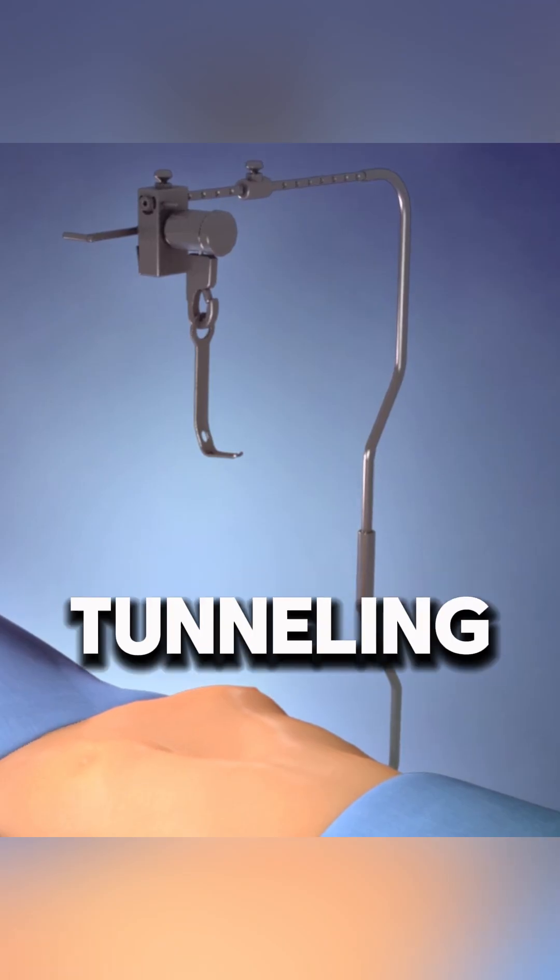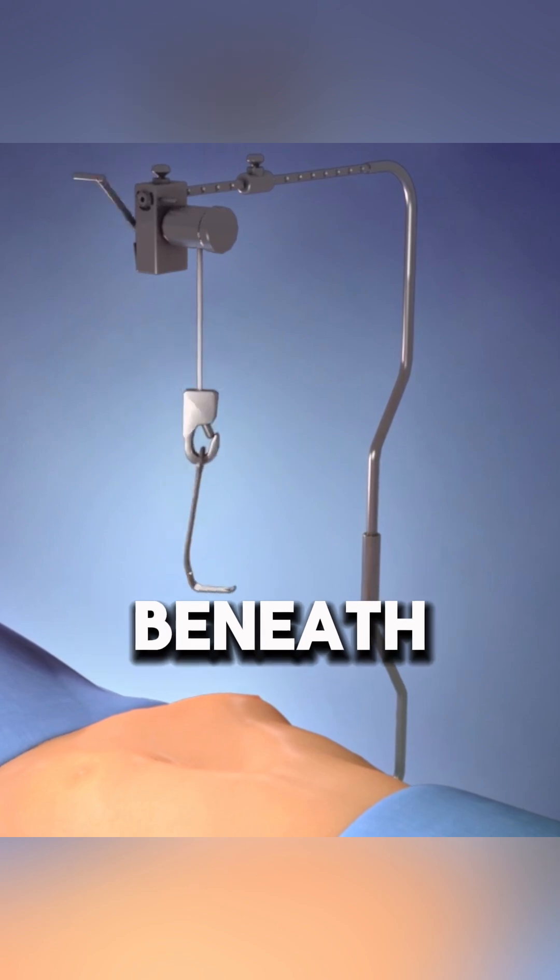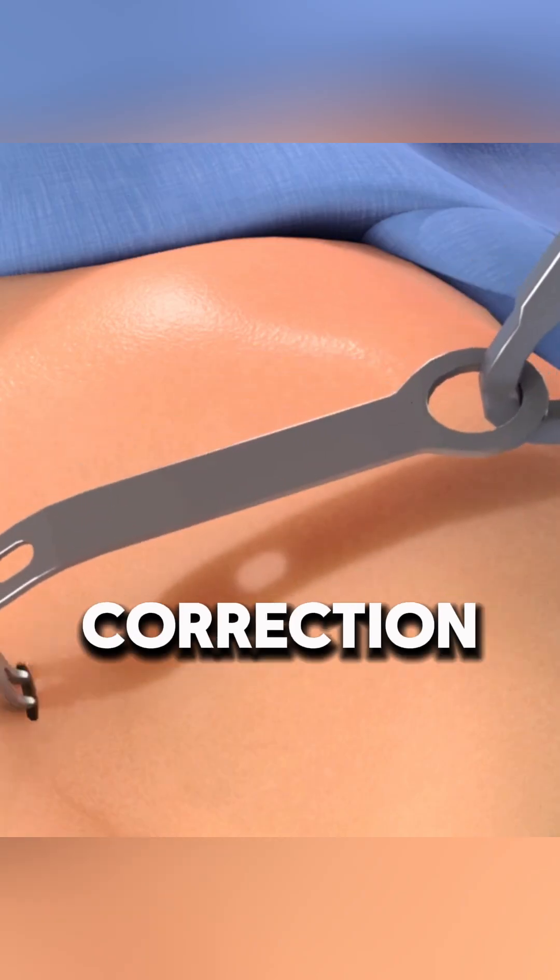Bar placement: a tunneling instrument is inserted beneath the sternum to create a path for the correction bar.